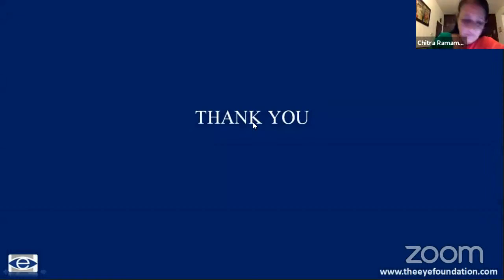Thank you, Dr. Faisal, for bringing back to us some of those pearls which we used to really hold on to in our earlier days and still would at any time point. I just have a question for the expert panel, and of course Faisal could answer too. When you're stuck with a thick leathery plate in these total cataracts, what are your tips for dealing with them?